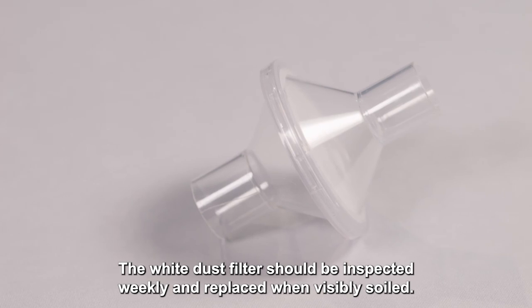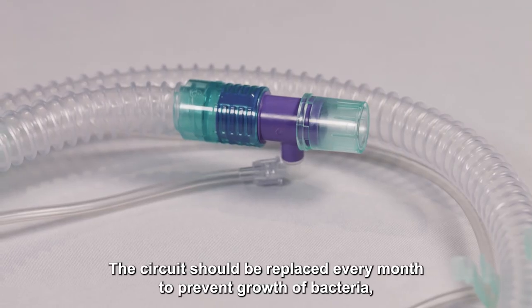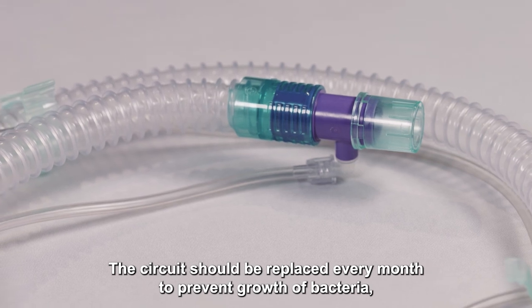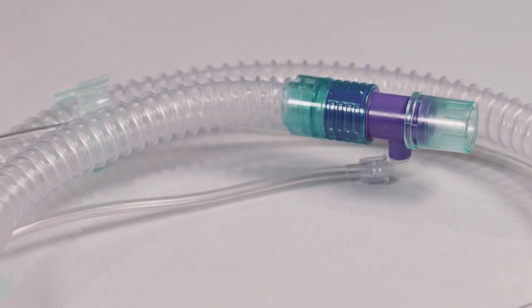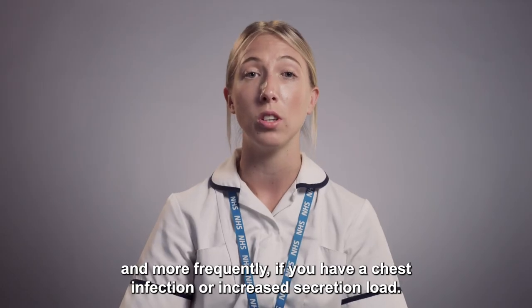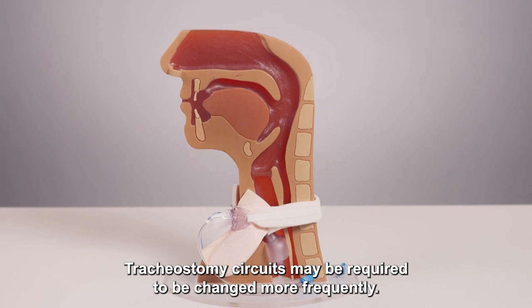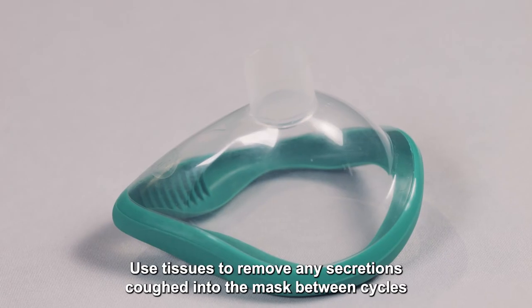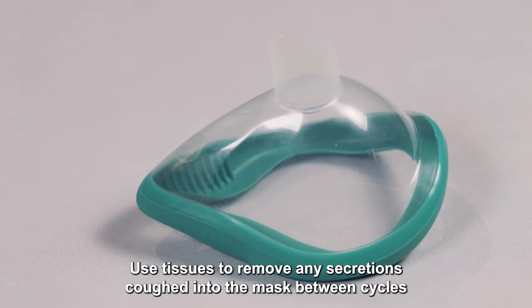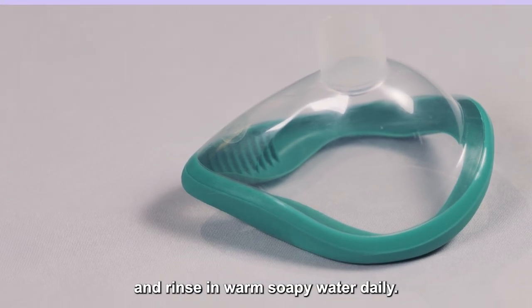The white dust filter should be inspected weekly and replaced when visibly soiled. The circuit should be replaced every month to prevent growth of bacteria, and more frequently if you have a chest infection or increased secretion load. Tracheostomy circuits may need to be changed more frequently. Use tissues to remove any secretions coughed into the mask between cycles, and rinse in warm soapy water daily.